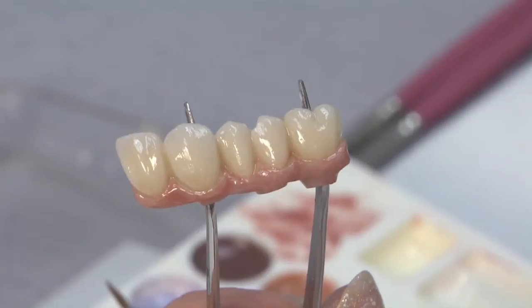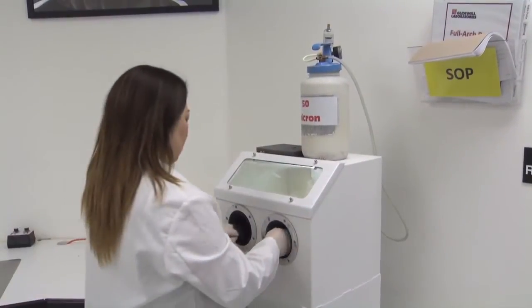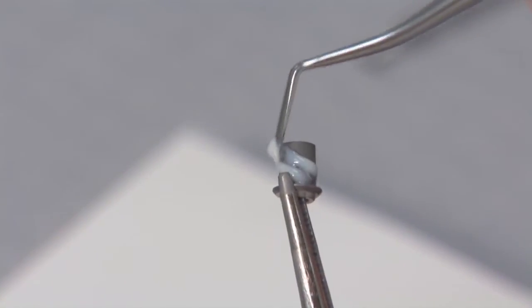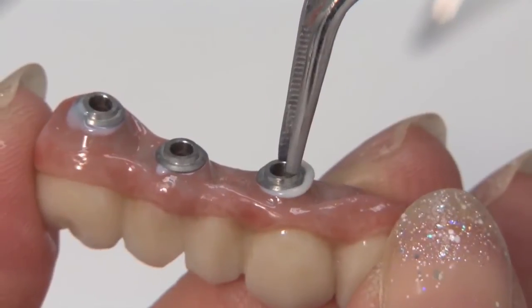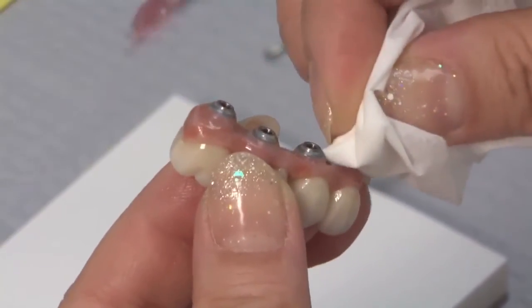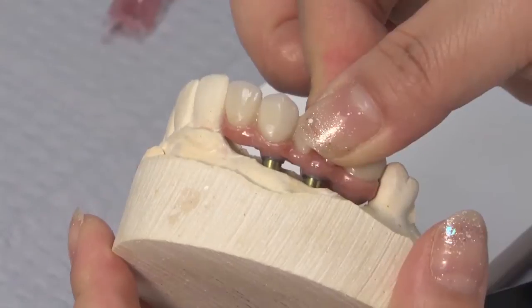In preparation for delivery, the titanium copings that connect the prosthesis to the implants are sandblasted. After applying a bonding agent to the copings, they are cemented onto the prosthesis. Any excess cement is removed, and the prosthesis is placed on the model.